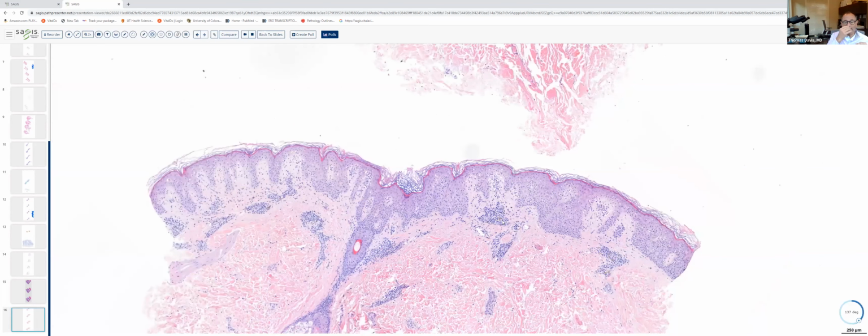And this was clinically a classic fixed drug eruption. Fixed drug eruption can present with basket weave cornified layer, especially if it's biopsied fairly early in the course. But the key differential with fixed drug eruption typically is erythema multiforme. Both, as this case demonstrates, can have a basket weave cornified layer. What distinguishes them, the changes in the epidermis can be identical, is the presence typically of lymphocytes, eosinophils, and melanophages within a fixed drug eruption, and the presence of lymphocytes only in the setting of erythema multiforme.